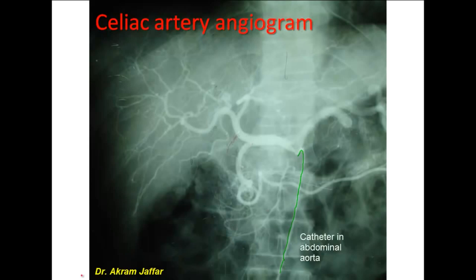You can see some of the branches of the celiac trunk. This is the splenic artery — it's a big branch, characterized by its tortuosity. The tortuosity of the artery is very clear. The other branch is the common hepatic artery.